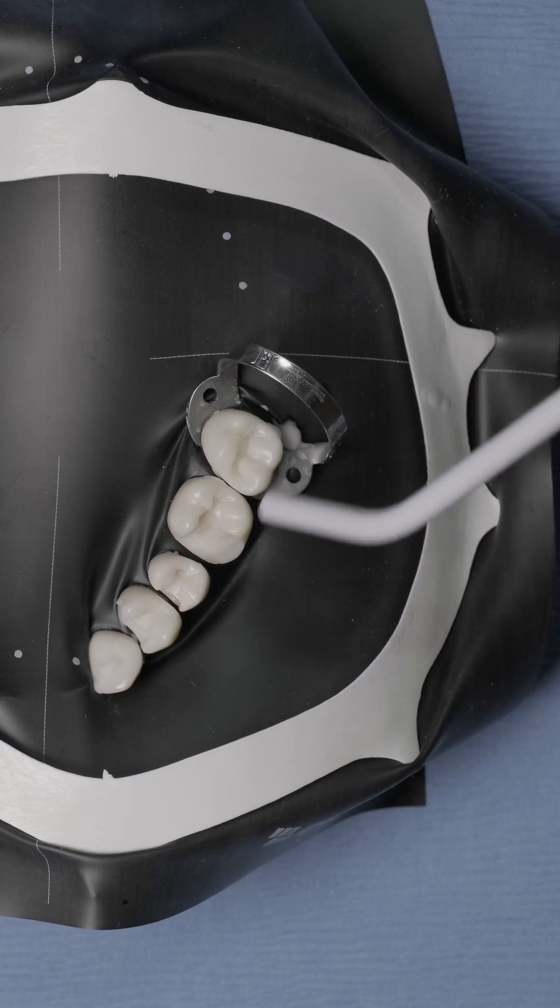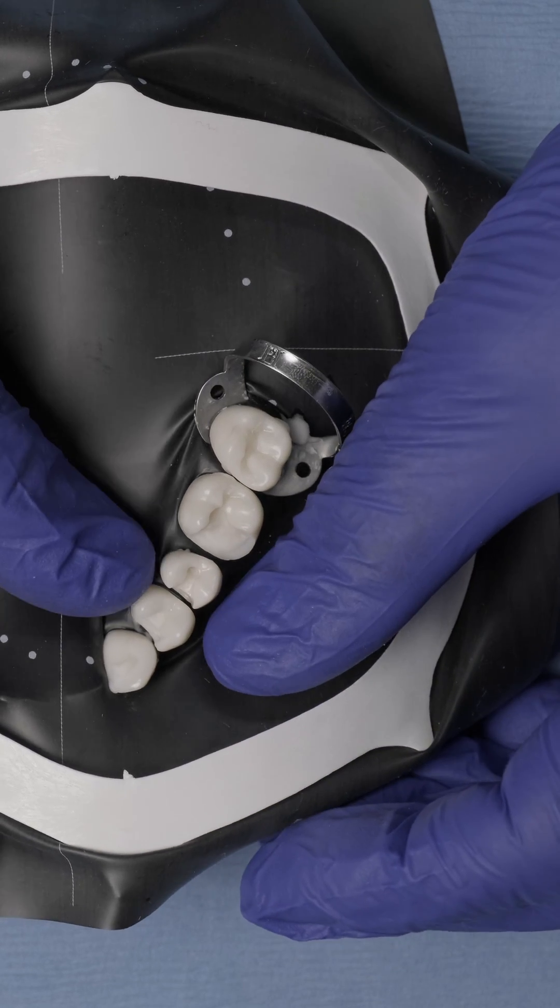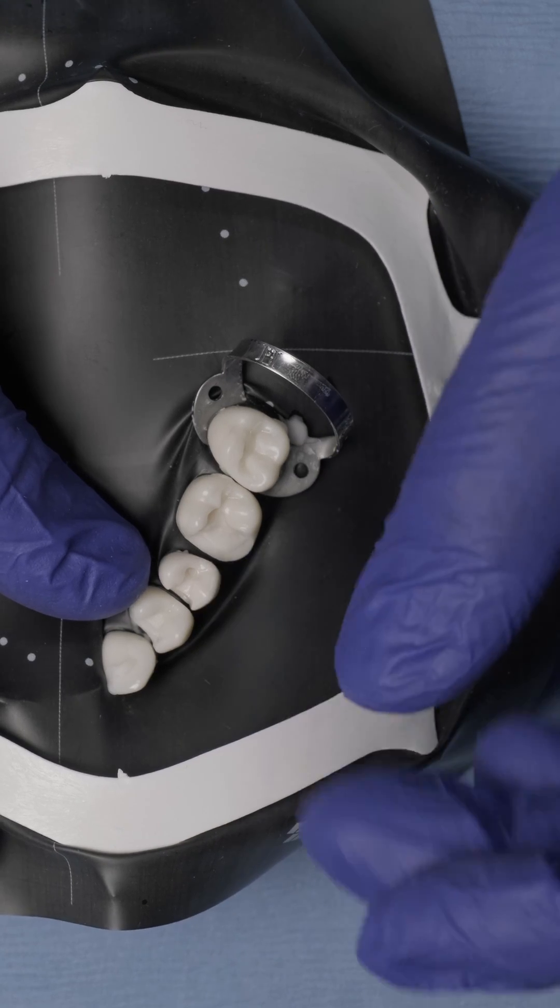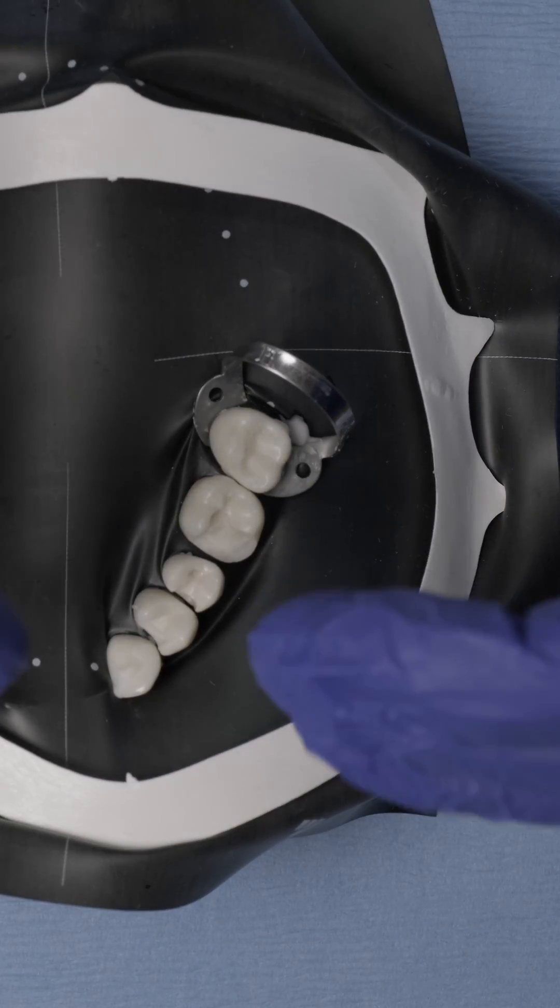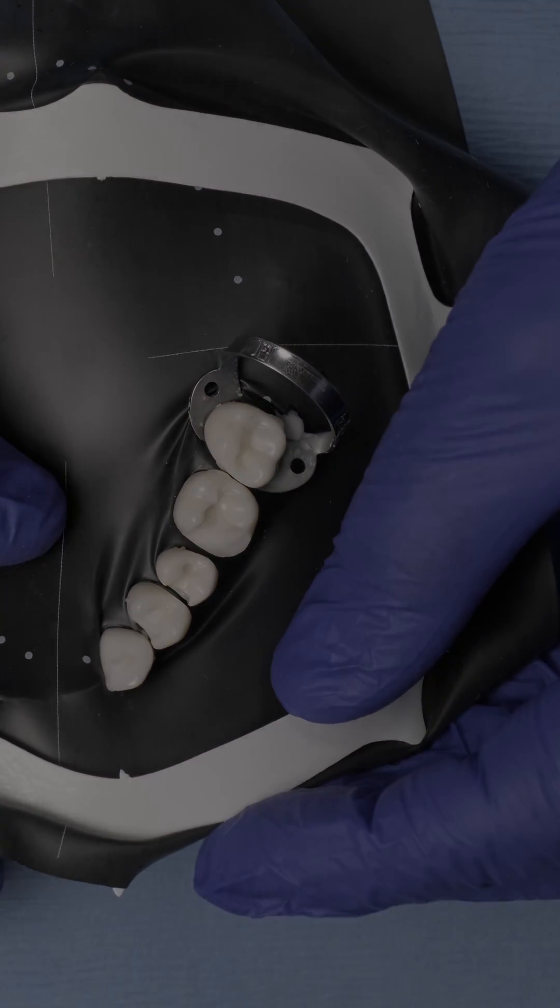they appreciate it because it makes it so easy for me to place a rubber dam. I rarely have to even floss through each proximal contact because the shaving cream literally makes the rubber dam act as a floss and just pushes through each contact area.